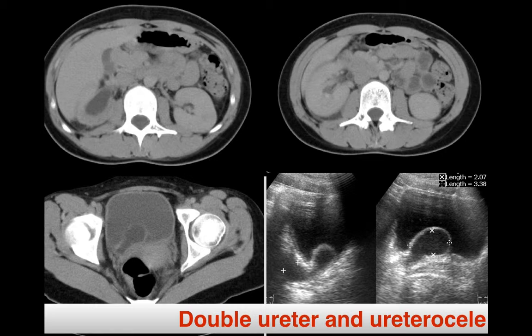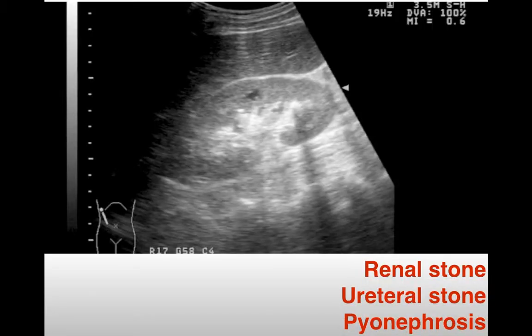So if you are trying to find out a problem, you'll be okay, use any kind of equipment. If you are trying to get a better image, get better equipment. The previous video I recorded using our own machine in our ER for the 13 year old. This one belongs to pediatrics. They got a better machine, got better quality. Okay. So then we can identify some kind of problem incorporated into this one.